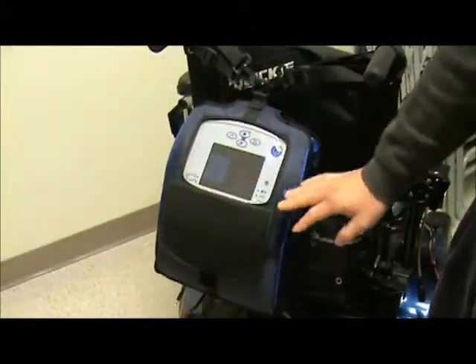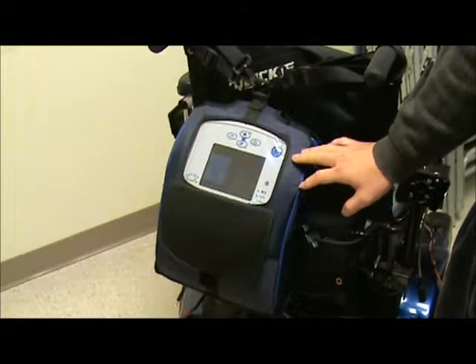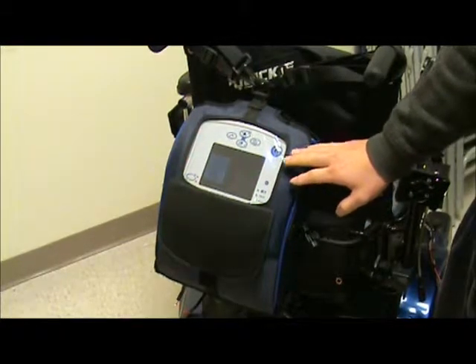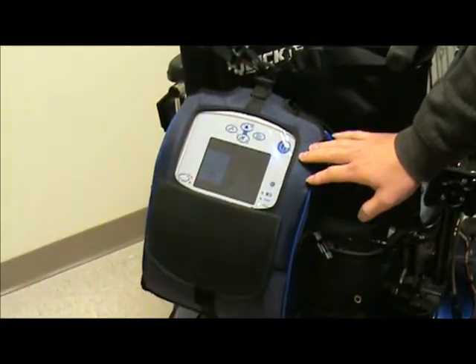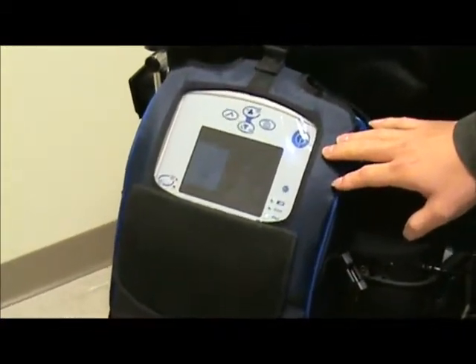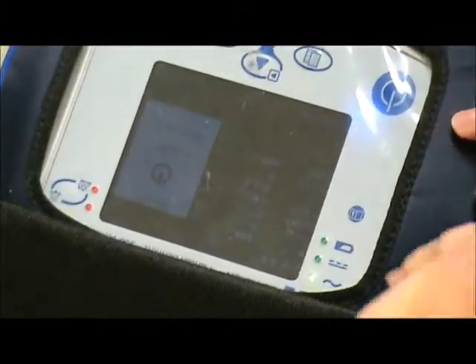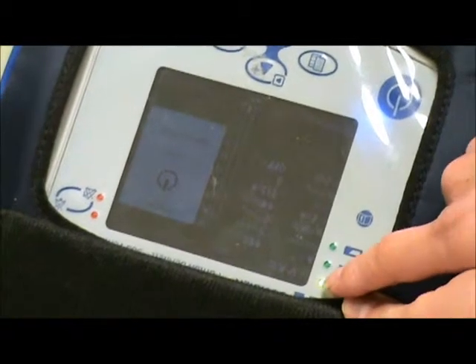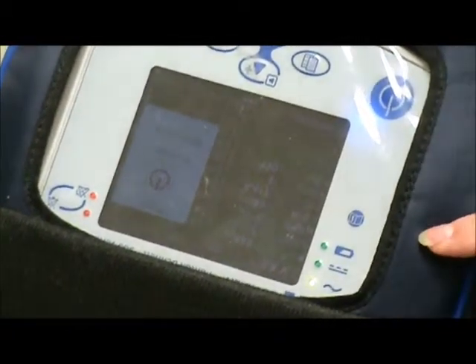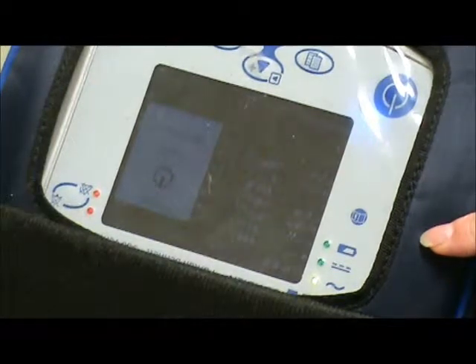This is our PB560 mounted at the back of the wheelchair, and usually you will find the ventilator mounted on the backpack like this. I'm going to show you the three lights that power the machine. The first light is the one with the sinusoidal sign. You will see that the light is lit up right now, which means the machine is connected to AC power.